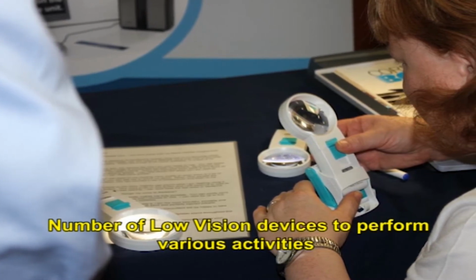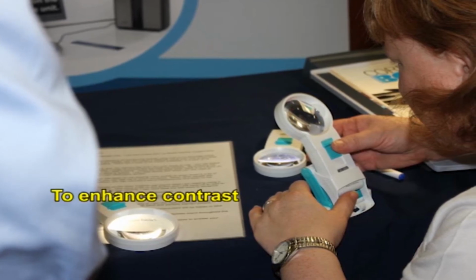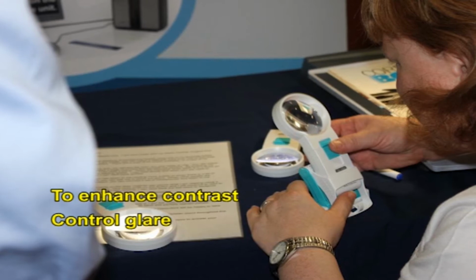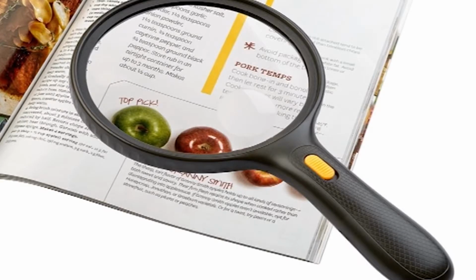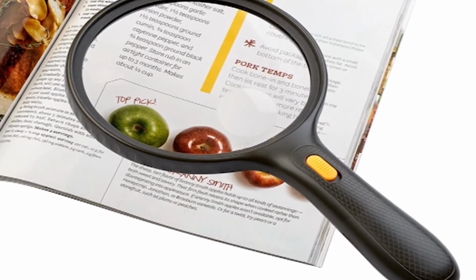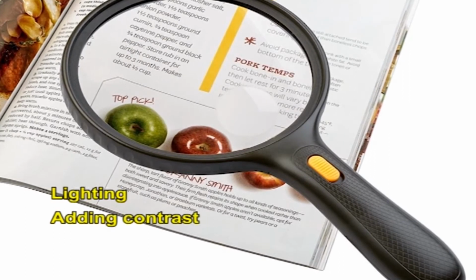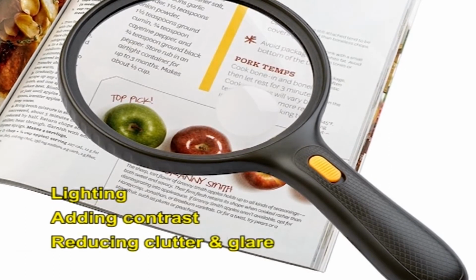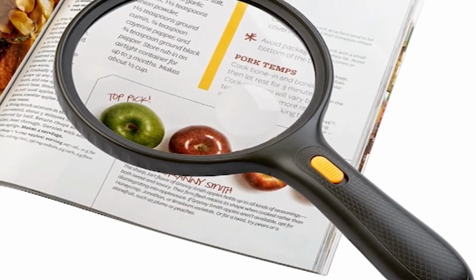The main principles behind low vision devices are to enhance contrast, control glare and magnify objects using various tools. Many people with low vision can benefit from either changes in the environment, that is lighting, adding contrast or reducing glitter or glare, or the use of low vision devices.